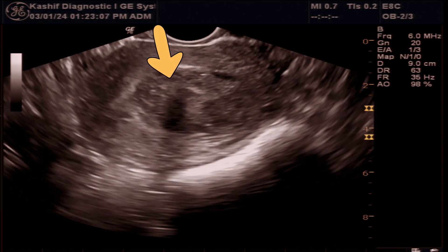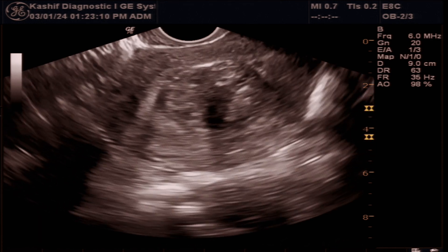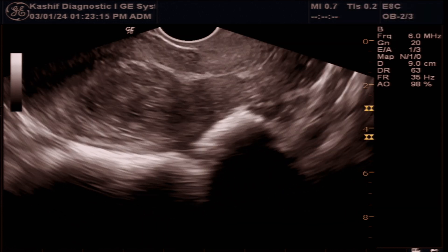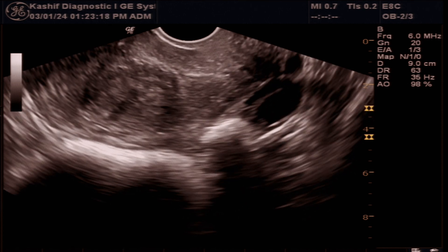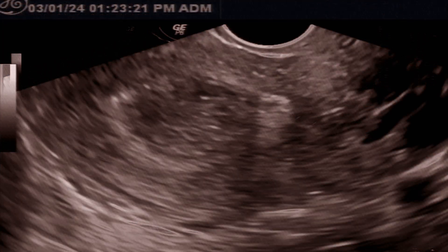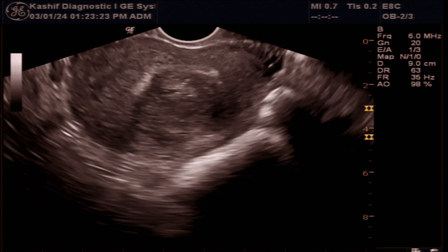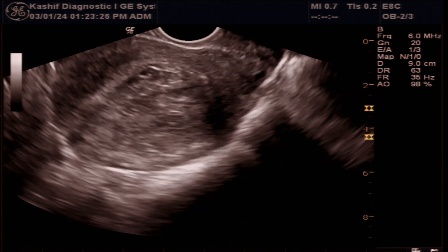In the uterus we see a well-defined fibroid of size 4.8 cm. Its location is from the mid to upper third uterine segment and it is pushing into the uterine endometrial cavity from anteriorly. This is a submucosal fibroid that grows beneath the inner lining of the uterus and into the uterine cavity.